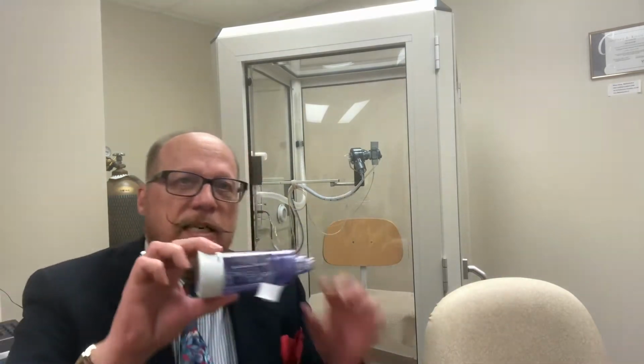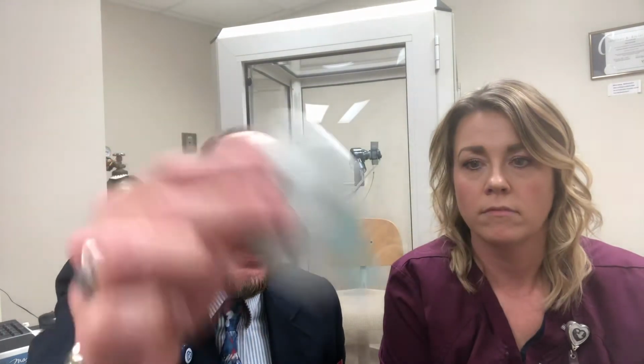One is a very fancy hard plastic spacer. Would you grab me that one over there? The other one is sort of an easy care makeshift spacer that works just as well. It just doesn't have a one-way valve as this one does. And these work with any metered dose inhalers, whether they are L-shaped or straight as this one is. It will not work with your powder inhalers that come in odd shapes like this or like this. And then there's also a round one, Advair, it's a purple disc.